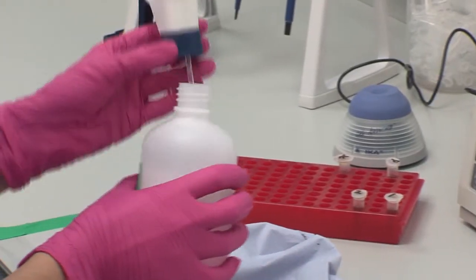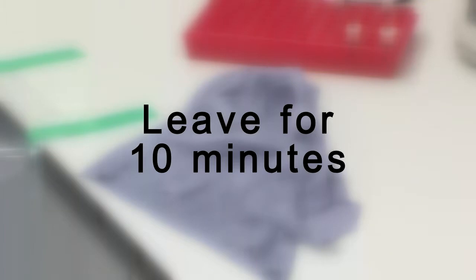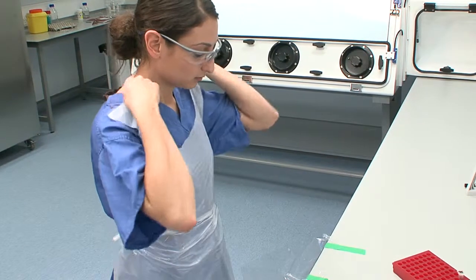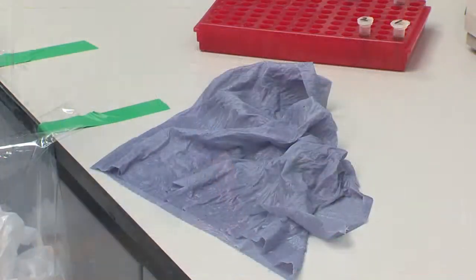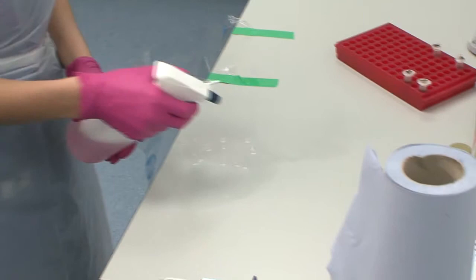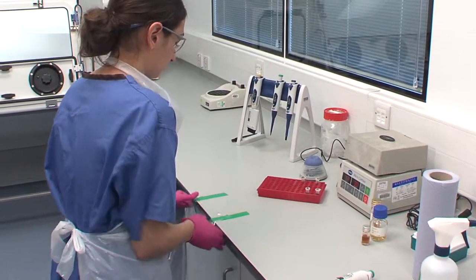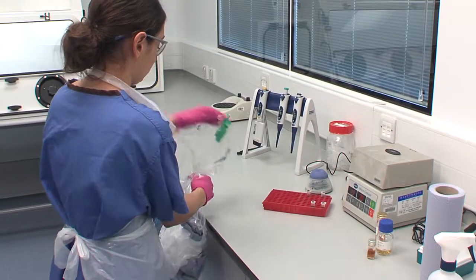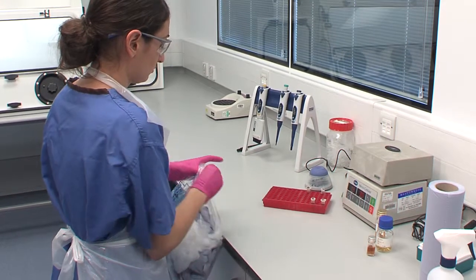flooded with 1% Virkon S, and left for 10 minutes. Any contaminated PPE should be discarded and replaced with clean PPE. After 10 minutes, the spillage should be mopped up with absorbent paper. Any materials used to clear the spill should be sealed in a bag and discarded with the lab waste for autoclaving. As with any spillage, consideration should be given to the implications of the spill on sample integrity.